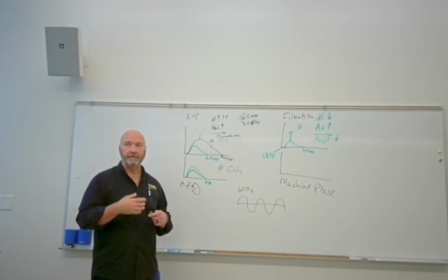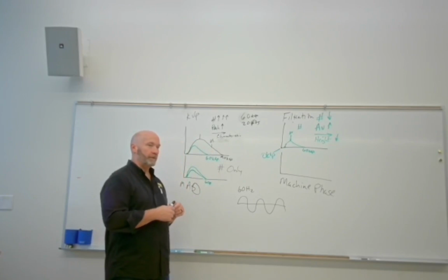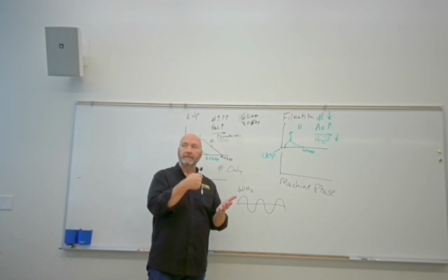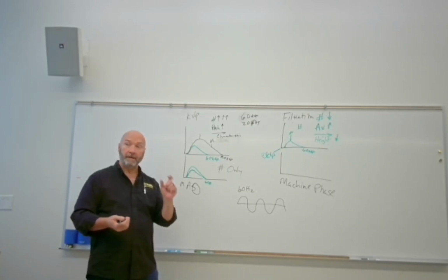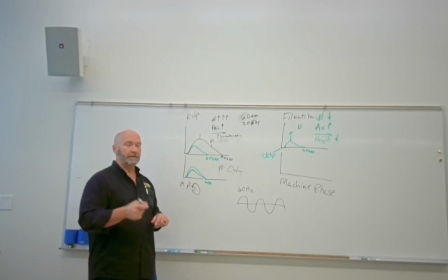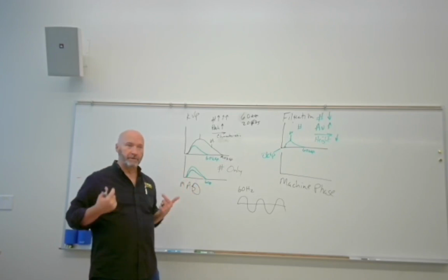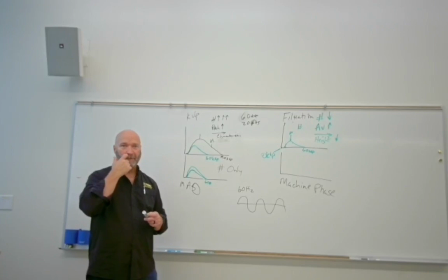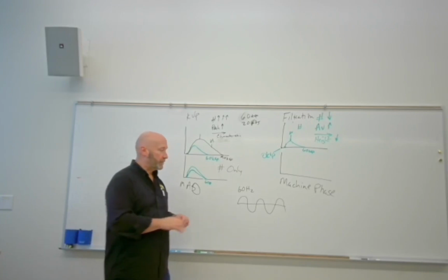It was a stationary anode, and it just melted it to pieces. So if it can melt that tungsten and the copper, a big hunk of metal, what could it do to that little bitty thin tungsten filament if the electrons were coming from anode to cathode? Same thing real quickly. So we don't want that to happen.